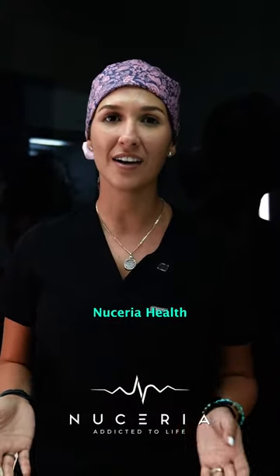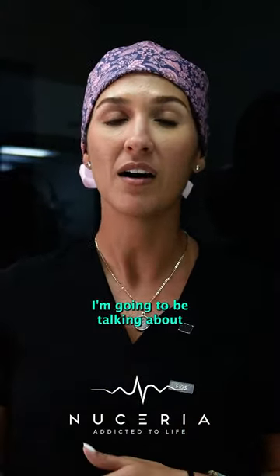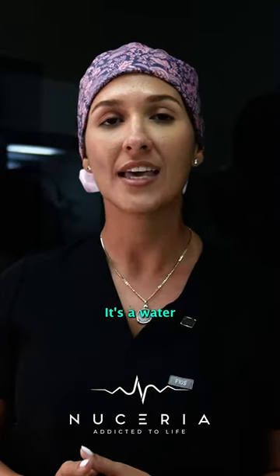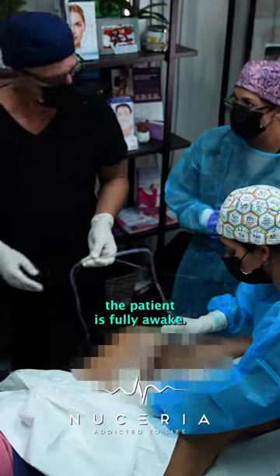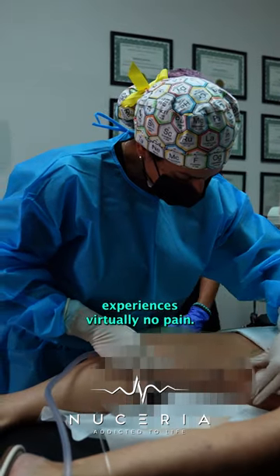Hi everyone, my name is Michelle here at Nuceria Health. Today I'm going to be talking about a procedure we've done in office — it's a water jet liposuction. During this liposuction, the patient is fully awake and experiences virtually no pain.